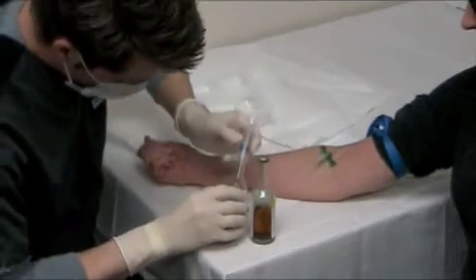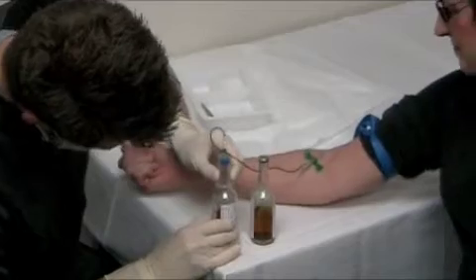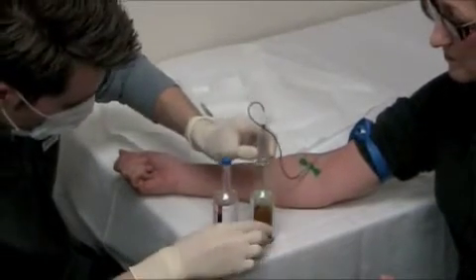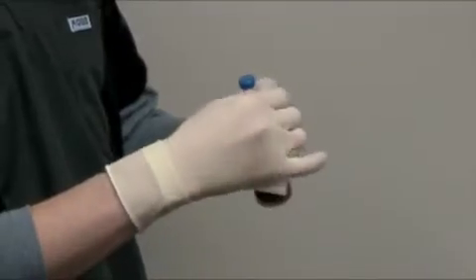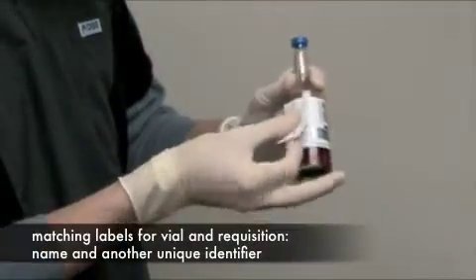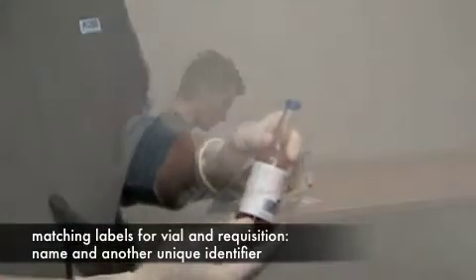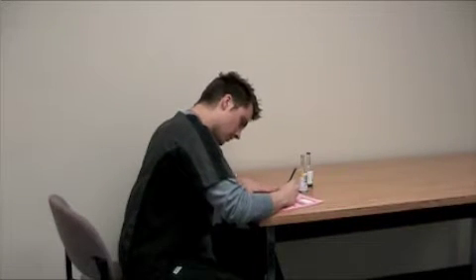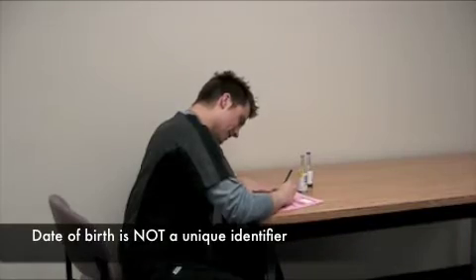Don sterile gloves immediately prior to venipuncture. Between 5 and 10 mls of blood should be collected per vial. Specimens for the aerobic vial should be drawn first, in order to prevent air from ruining the anaerobic environment. Do not cover the vial barcode or bottom while labelling. Specimen and requisition require matching labelling that includes the patient's name and another unique identifier, such as health card number or hospital unit number. Date of birth is not a unique identifier.